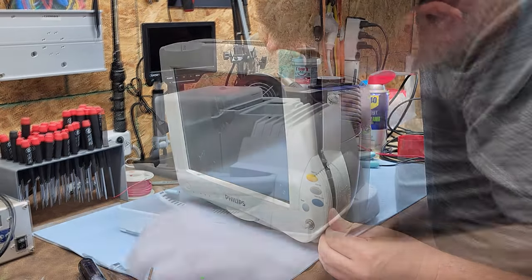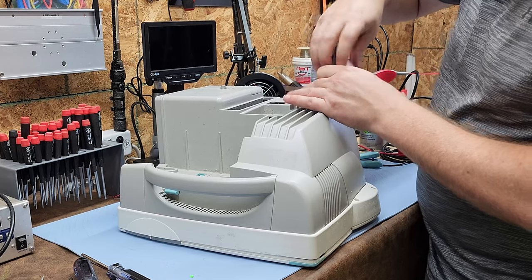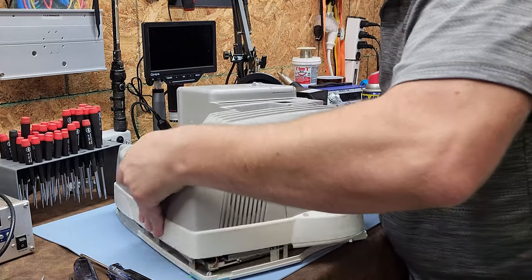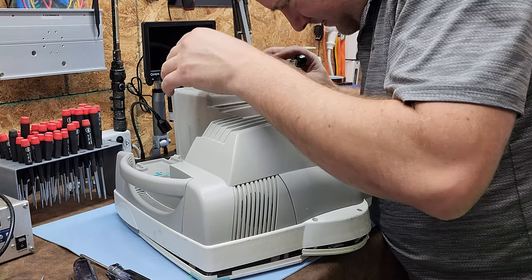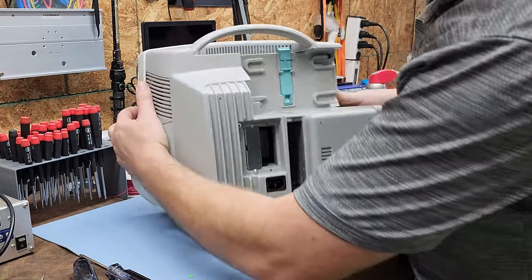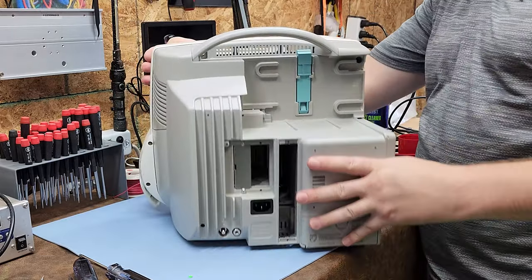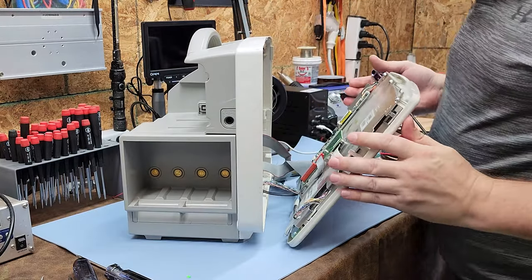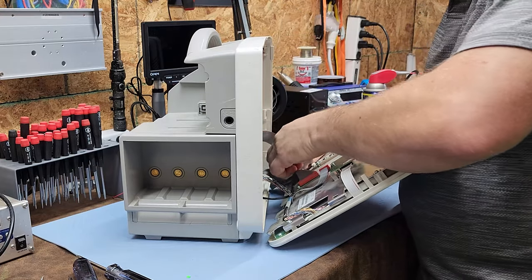Philips, did you really do this? You guys that have had to take these apart know exactly what I did wrong. In this tiny little hole right here, there is a stud that holds this front panel together. As soon as you loosen that one, the front panel comes right off.